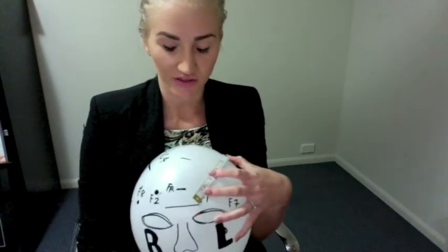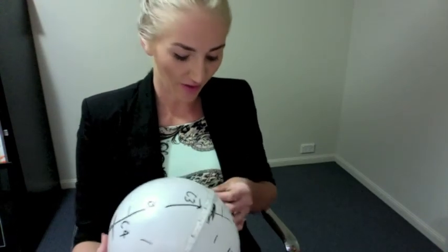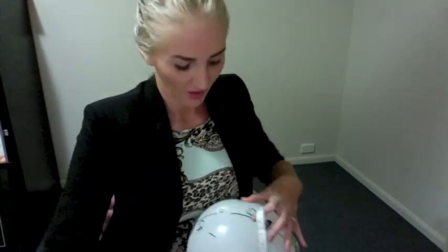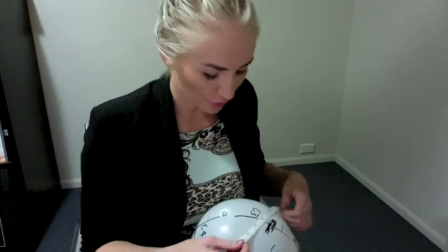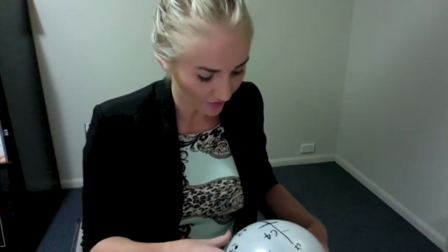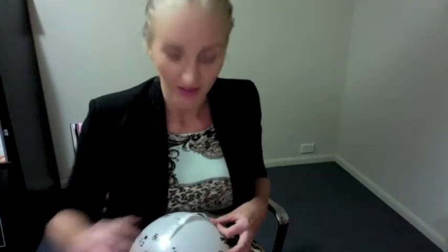So next is to determine the parasagittal lines. We do this by measuring from FP1 to the back at O1. Now this measurement is 26, so we go 50% will give you your C3 mark, and if you repeat on the other side, that will give you your C4 mark.